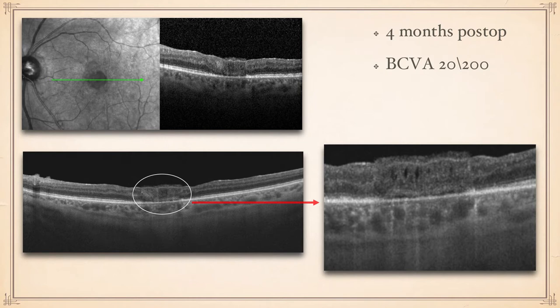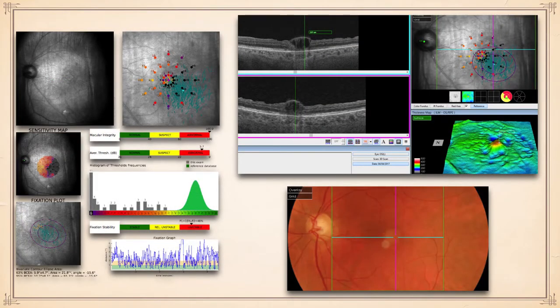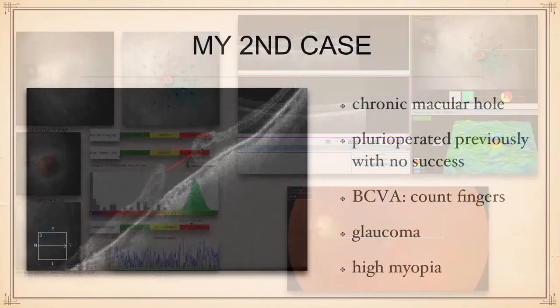At high magnification, you can see initial cystoid changes in the flap, and this new epiretinal tissue. It seemed to me like the patch was not integrating at all. And in fact, 2 months after, I could see a complete degeneration of the flap with atrophic changes, cystoid changes. So it was a complete failure.